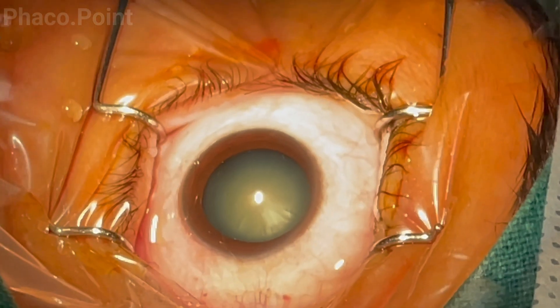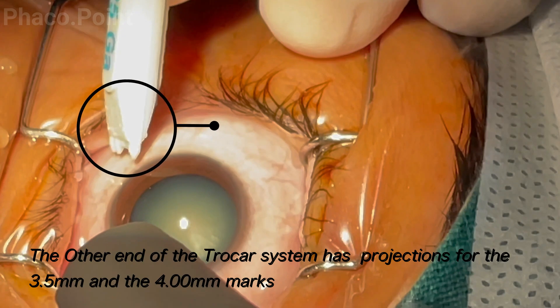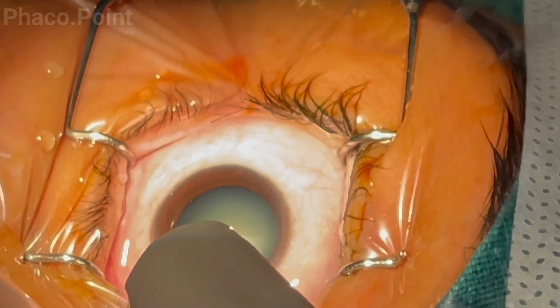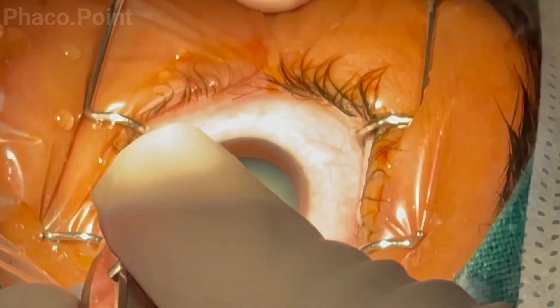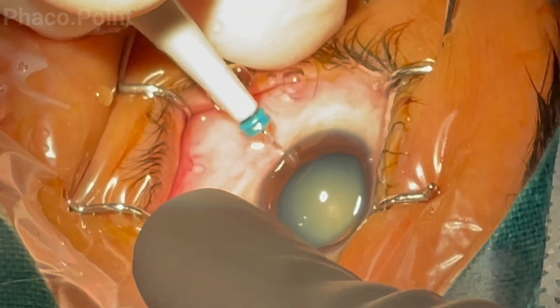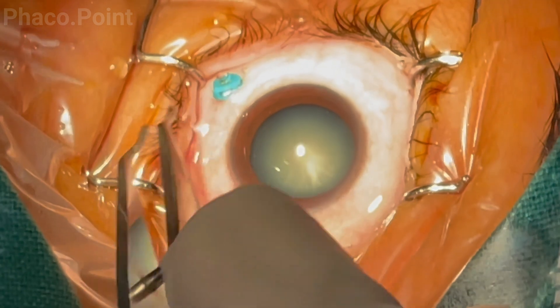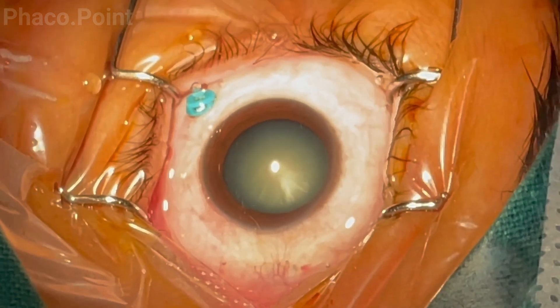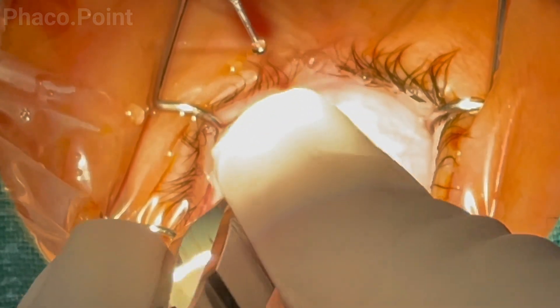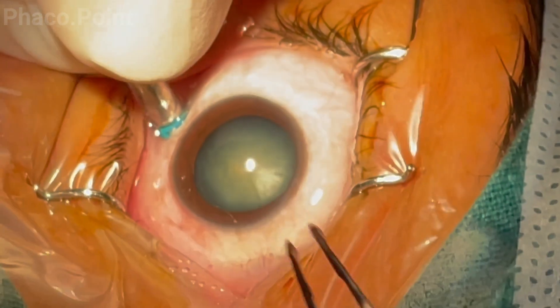This surgery is in a patient undergoing phacoemulsification and silicone oil removal. Being a phakic eye, the surgeon marks the 4mm point posterior to the limbus inferotemporally for placement of the trocar cannula that houses the infusion. The trocar cannula is introduced into the eye 4mm behind the limbus. The trocar is then removed, leaving the cannula in place. The posterior end of the trocar provides the marking of 3.5 or 4mm to confirm correct position. The infusion cannula is primed, turned off, and while stabilizing the cannula, the infusion line is connected to the infusion port.